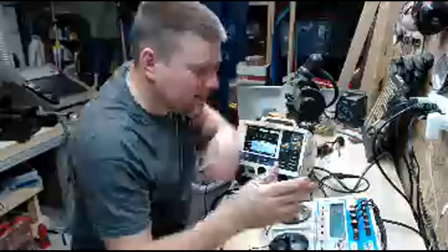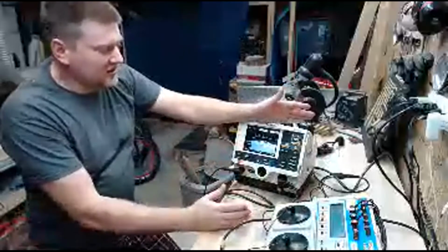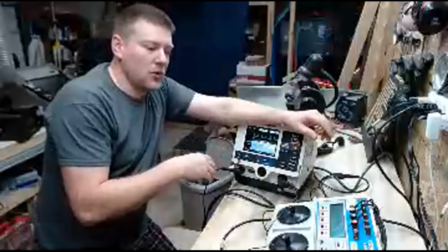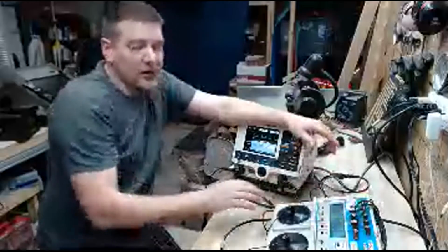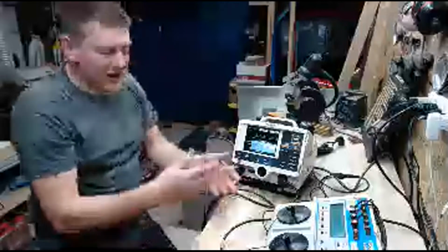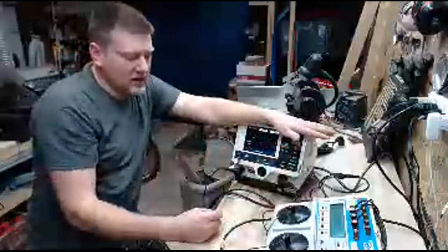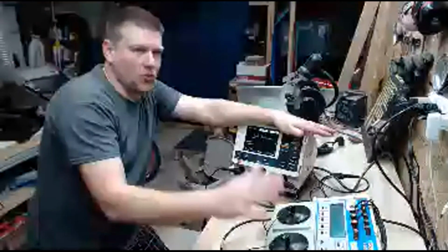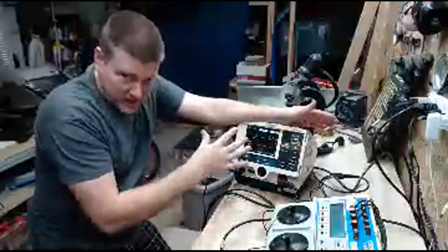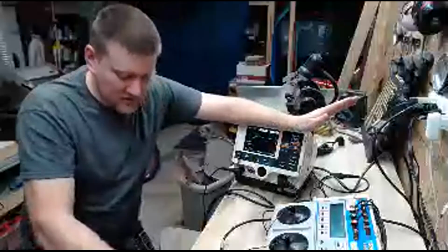All right, so when we do demand, we come to our analyzer, go to demand, and it's going to take a sample of your pulses and put your heart rate through your ECG leads. It's going to put the heart rate above and below the demand level. It's a test that we used to have to do manually. Manually, I would have it set to, let's say, 100 BPM, I would have to set this analyzer to 120, and then turn it down to like 90 or 80 and see when does it pulse, when does it not pulse, okay? If you guys don't really understand what I'm talking about, I can definitely go into some more detail.